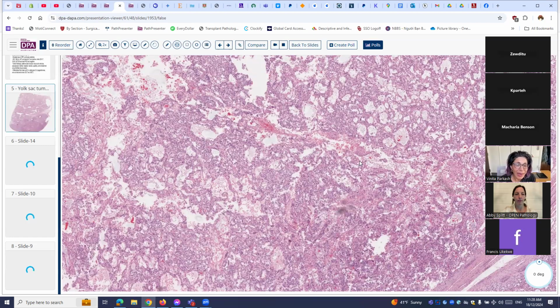If the patient did not have an AFP elevation, I would be concerned that I was missing the diagnosis, so I would do a battery of stains, because yolk sac tumor invariably has very high levels of AFP. That would be truly unnerving to me. But PLAP, CD117, CD30, though I've never seen an embryonal one look like this. No, I haven't either.